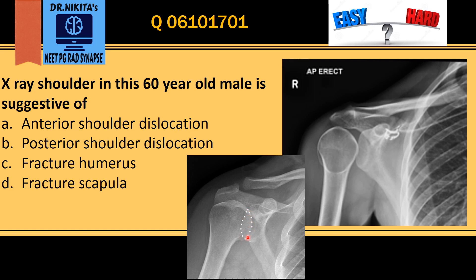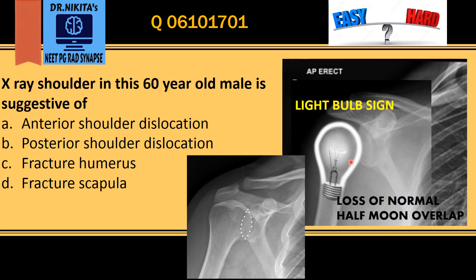That is the normal half moon overlap. What happens here is the overlap between the humeral head and the glenoid is lost — there is loss of the normal half moon overlap. Plus, the head of the humerus is more globular and looks like a light bulb — that is the light bulb sign of posterior dislocation.